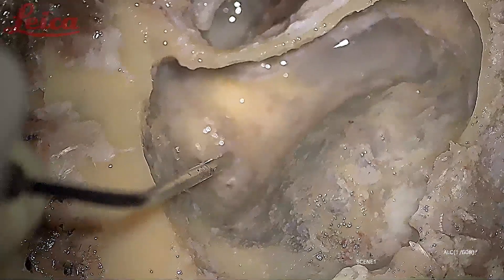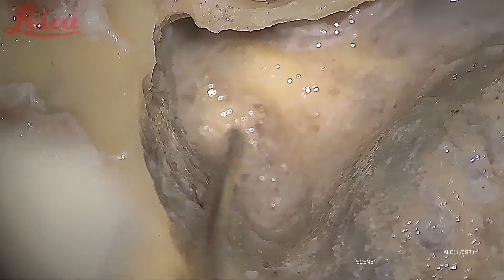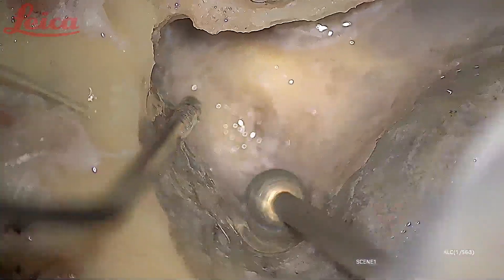These are all air cells here — you can easily make out the difference between the air cells and when you find the semicircular canal. What you are seeing here in this yellow color is the superior semicircular canal, but it is still hidden beneath a few air cells which still have to be drilled out.